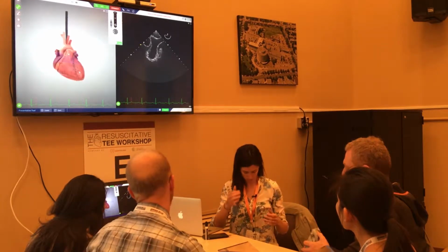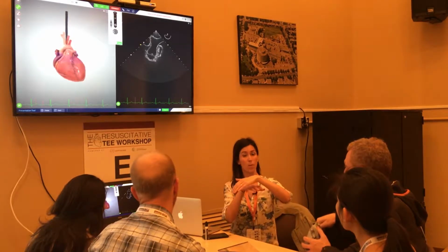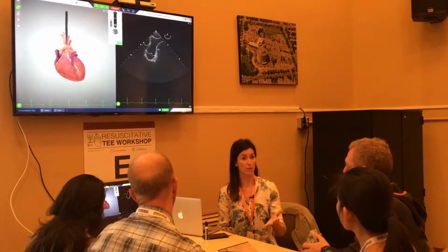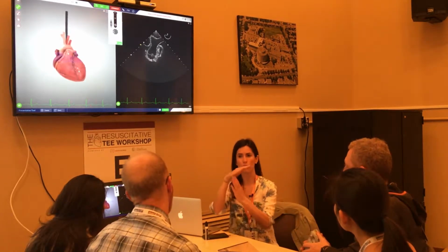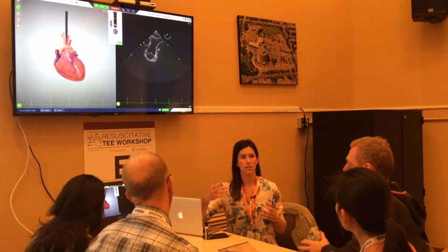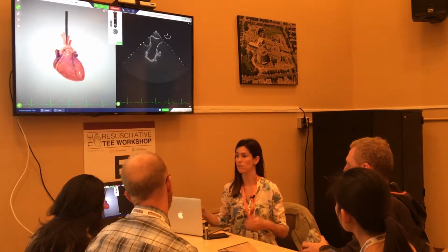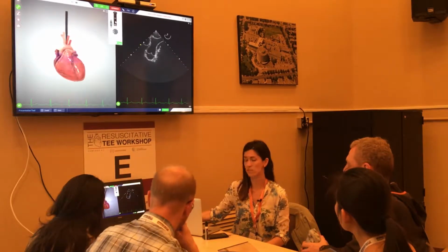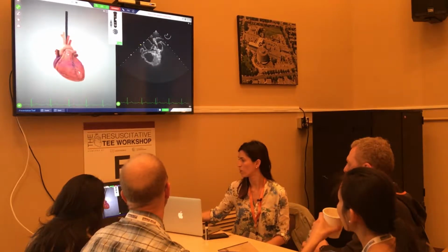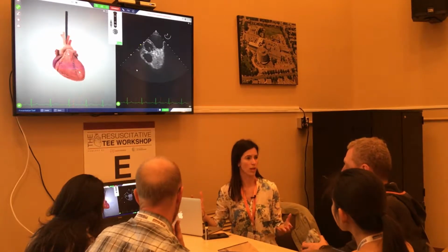What is the next thing that we're going to see? So we've seen the pulmonic valve. What's the next valve or aortic valve, right? So knowing that the 2 valves are perpendicular to one another, we've just seen the pulmonic valve in its long axis. Is the aortic valve going to be in its short axis or its long axis? Short axis. They're perpendicular to one another. So we're just staying at 0 degrees, advancing the probe, and we see that aortic valve in its short axis.